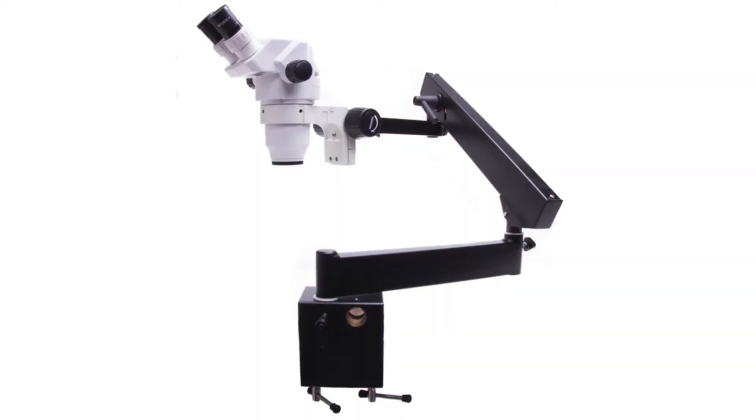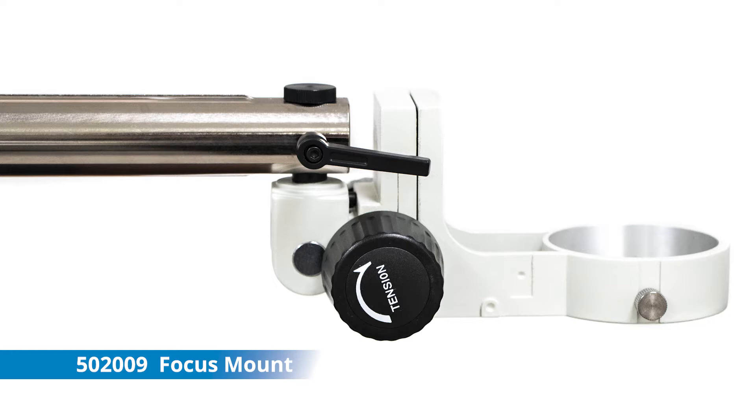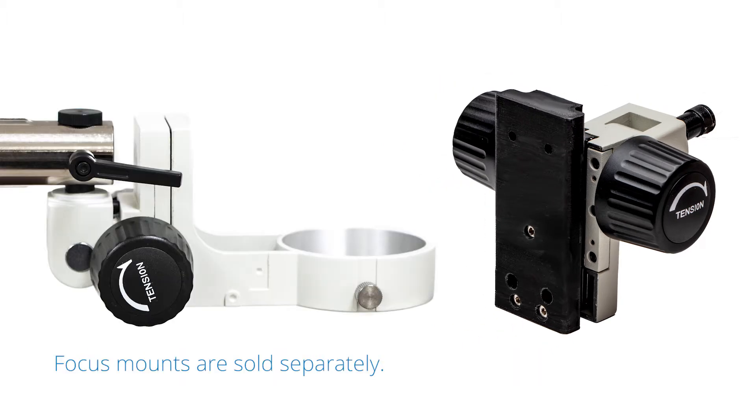Today we will set up the articulating arm clamp stand for a microscope. This focus mount is used with the PZM-3, while this one is designed for use with the new enhanced reality macroscope. The focus mounts are sold separately.